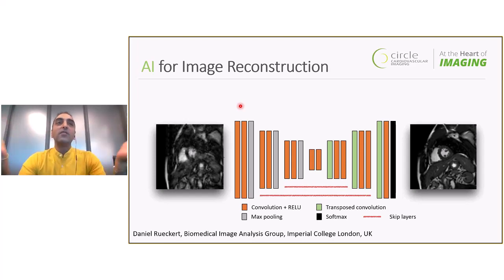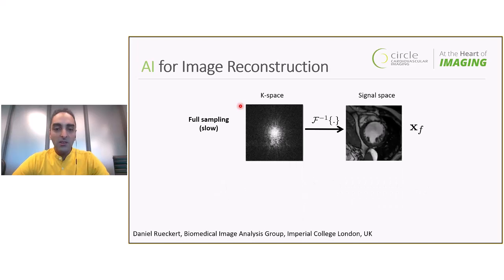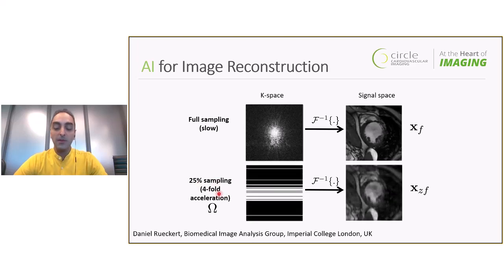And one thing that's true of all video sequences is that there's quite a lot of redundancy in these sequences. If I can go back to this slide and play the video again, you can see that there's a lot of places where the tissue is static and it's not moving, and even in the parts that are moving, they're more or less the same structure, right? It's not like the video is changing much. So there's a lot of sparsity there. There's a lot of redundant information when we're looking at a sequence as a whole. So when we want to reconstruct from the whole video, maybe we can reduce the sampling further. Instead of throwing out 75% of the K-space information, perhaps we can throw out more.